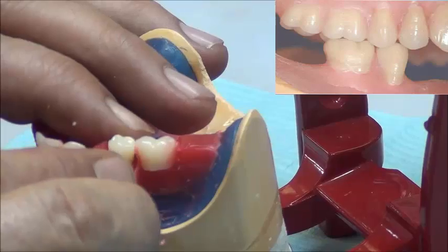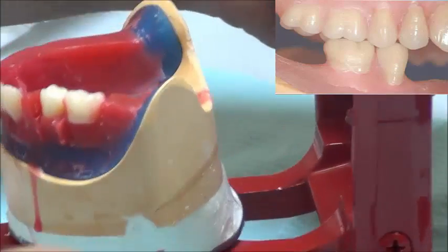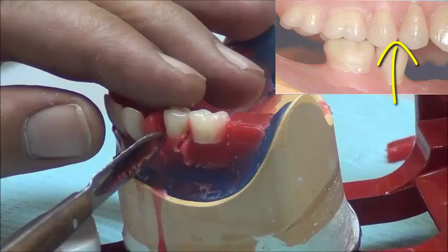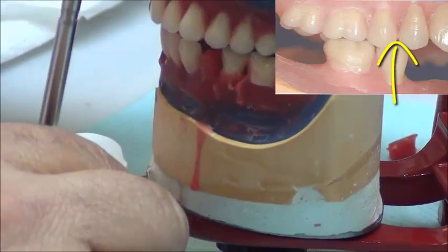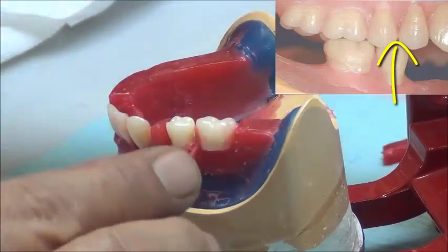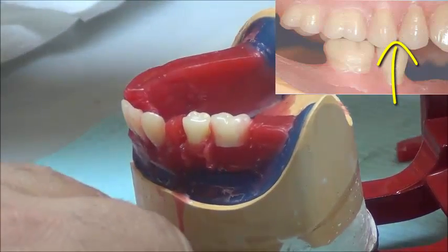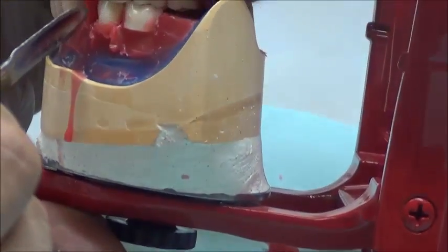So tooth number 5 will interdigitate with upper tooth number 5. So we put it into location. We open a box just enough for it. And once more, the upper cusp will go down. So tooth number 5 is in between upper tooth number 5 and tooth number 4. So it's in location now.